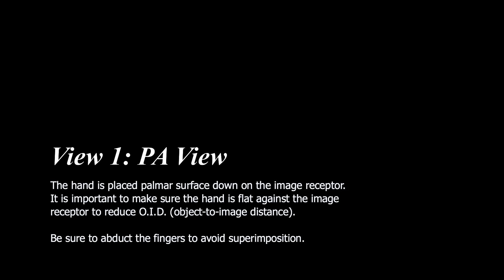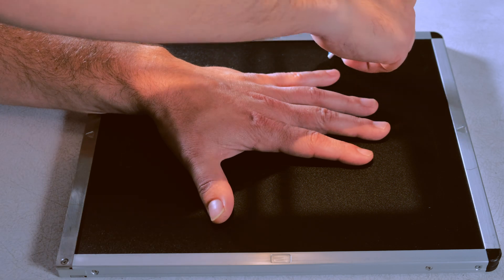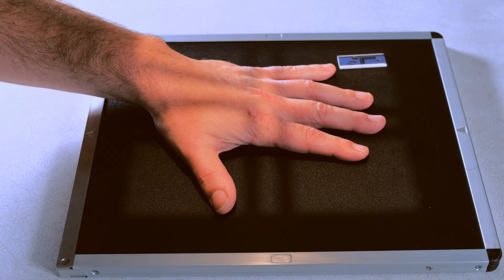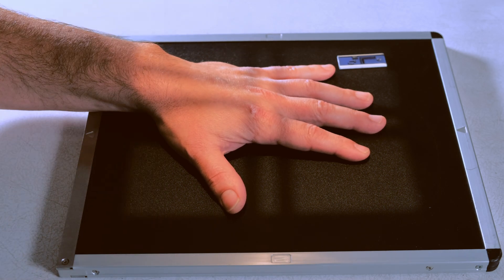Let's start with the PA view. Our first view is going to be of the PA position for the hand. We're going to mark our film. We're going to use the third MCP joint for our central ray and always include the distal row of the carpals.